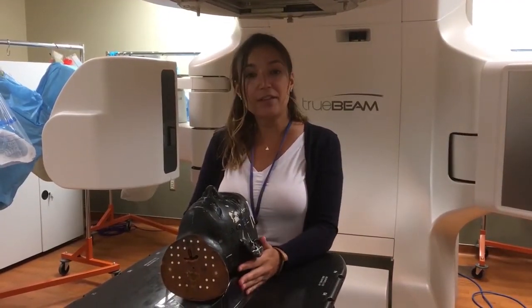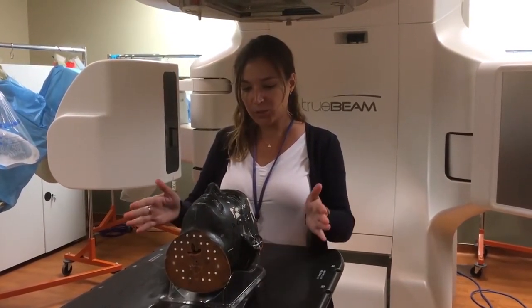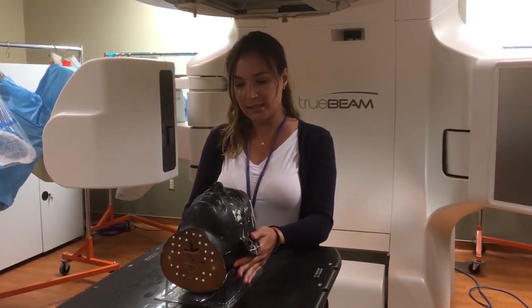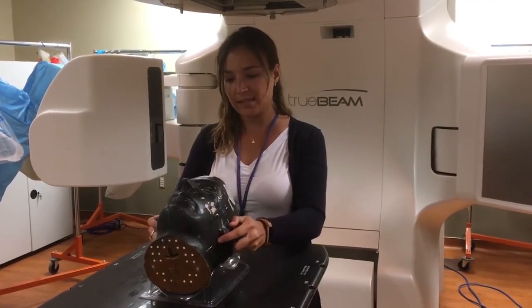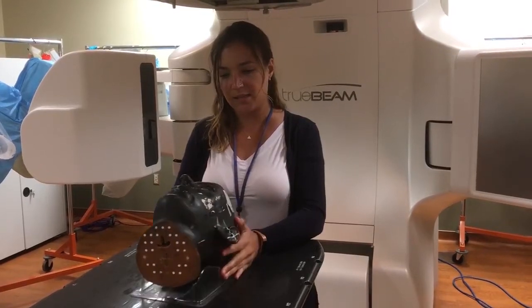So to clarify the rotations that we were discussing during the imaging portion of the video, I just wanted to show you guys what it looks like with the phantom. So this rotation right here, that would be the roll. This is the pitch, and this is the yaw.